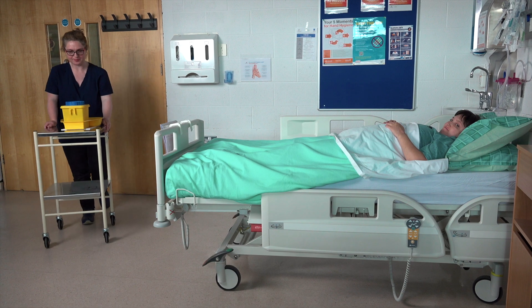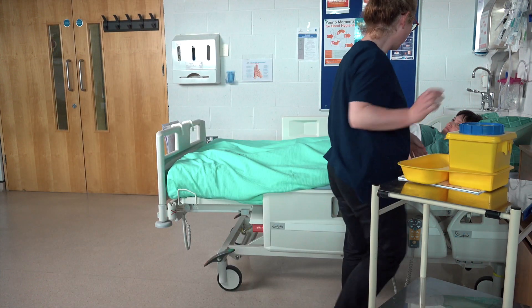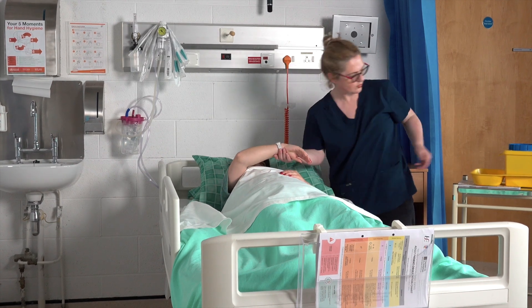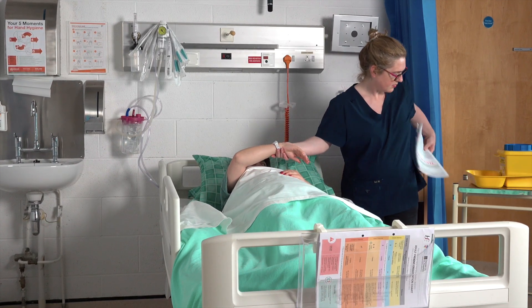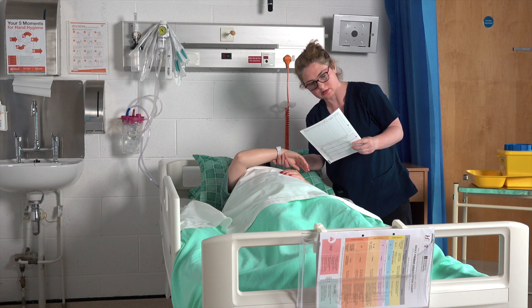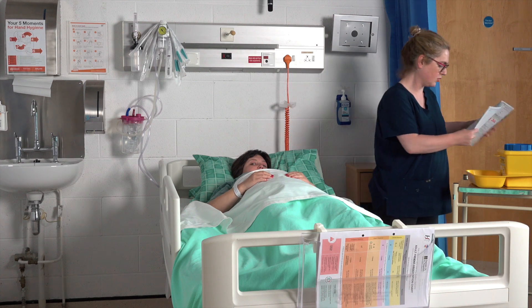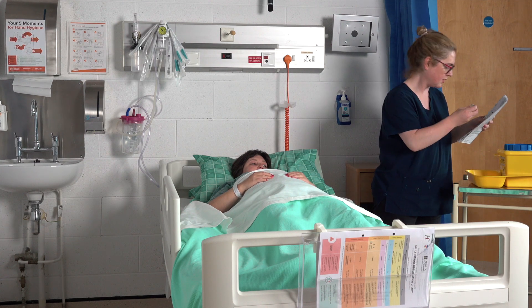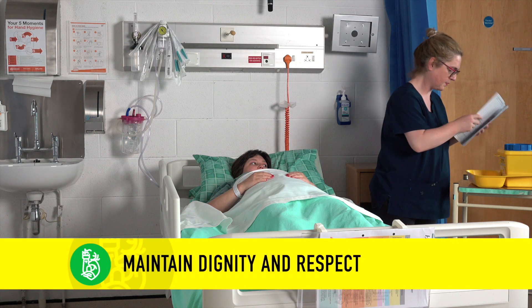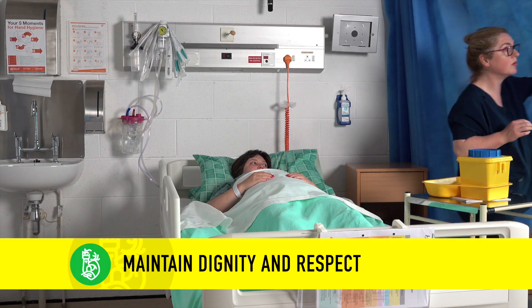Introduce yourself to the patient, explain and discuss the procedure with them, and gain their consent. Ask the patient if they would like a chaperone to be present during the procedure, and check if the patient has any allergies. Follow the 10 rights of medication management to reduce the risk of medication errors. Carry out hand hygiene, risk assess for the necessity of wearing personal protective equipment, and maintain the patient's dignity and respect by closing the curtains for the procedure.